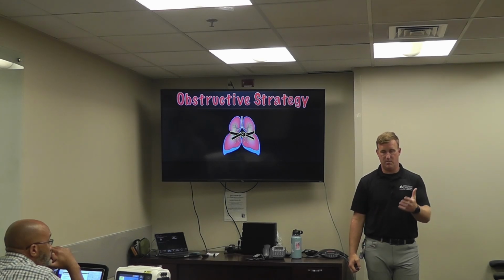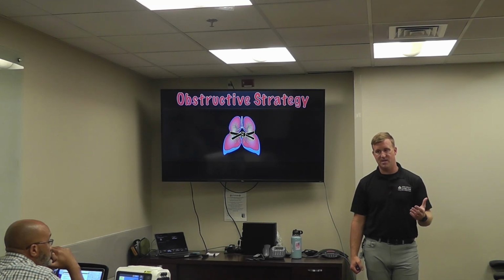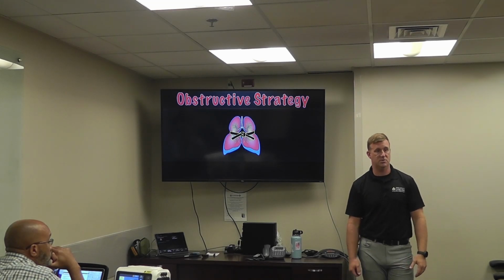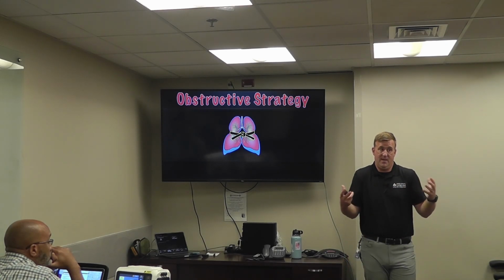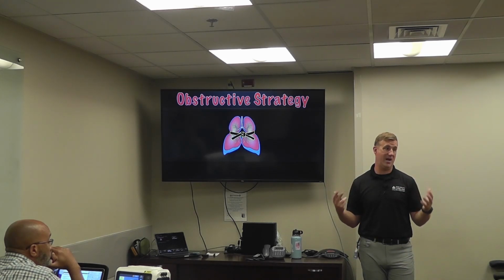So you'll see an emphysema patient, and I'm sure you guys have all seen it, doing the pursed lip breathing, right? They breathe in, and then it's a very, very slow exhale. And we need to mimic that. The reason they're doing the pursed lip breathing is they're trying to auto-PEEP themselves. But beyond that, they can't exhale quickly. They're having to forcibly exhale. Versus you, if I fill up your lungs, and you probably saw it when you were using BiPAP, your lungs are pushing that back out. You're springing back. And the reason for that is because you've got good, healthy, elastic lungs. They've smoked all the elasticity out of their lungs, and they have big, floppy, trash bag lungs.